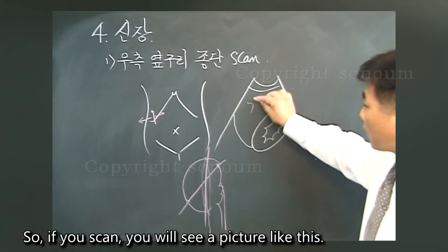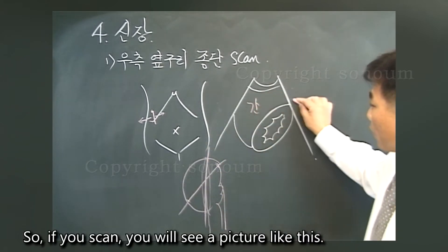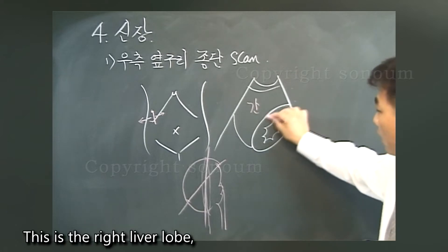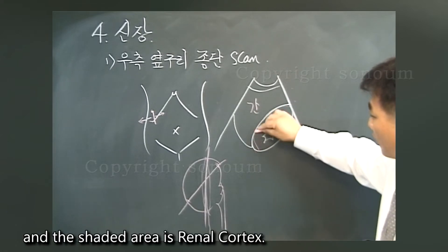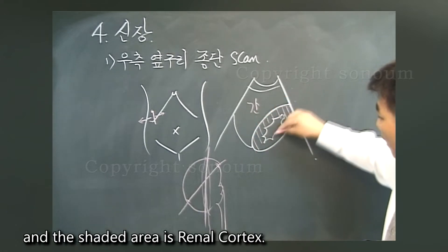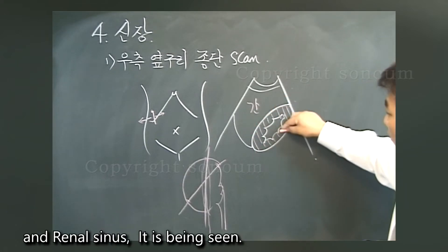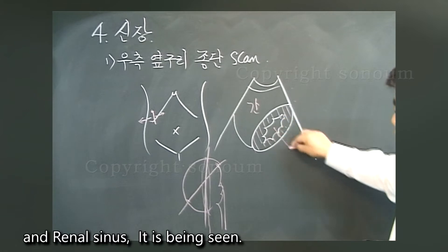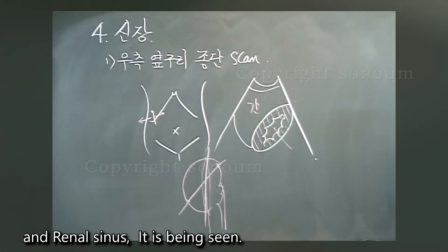If you scan, you will see a picture like this. This is the right liver lobe, and the shaded area is the renal cortex and renal sinus, which can be seen here.